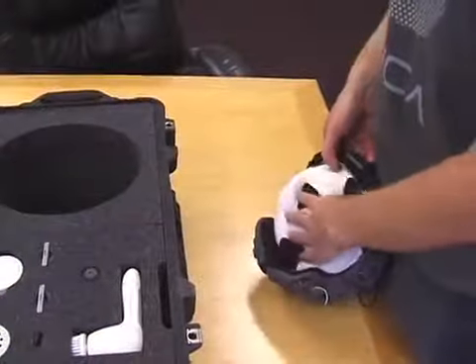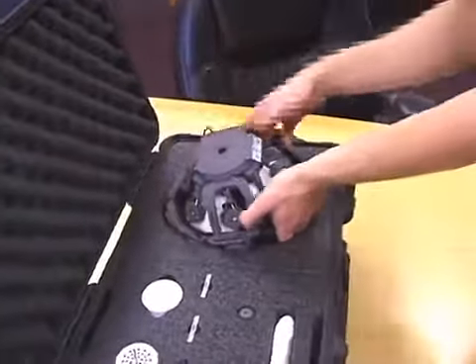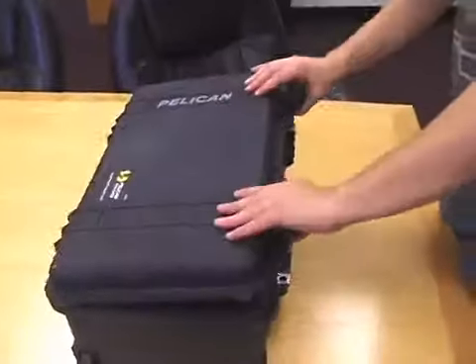For storage, stuff the supplied padding into the headset and return it to the protective case. For more information, visit the Wearable Sensing website at www.wearablesensing.com.